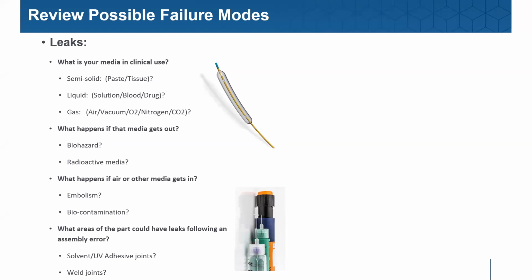And this oftentimes exceeds the budgets and would put a real twist in the manufacturing process for many of the manufacturers of such devices. And so to answer that question on those types of catheters, most customers are still dunking them, unfortunately. There's just not a better way to do that at the moment.